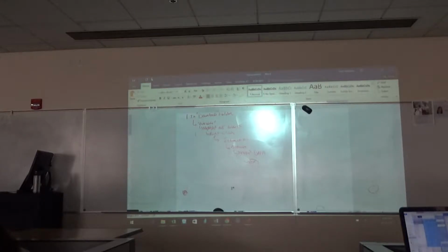Now, what's the value that you want to plot on the top right? You want to plot that instantaneous amplitude? Probably not, because you have two time points in the window. So you're going to plot the average amplitude or mean between those two latencies. Just like that. I like to add this little box here to display the color bar. Now, options. Let's say show me the bin description. That doesn't apply. Okay.